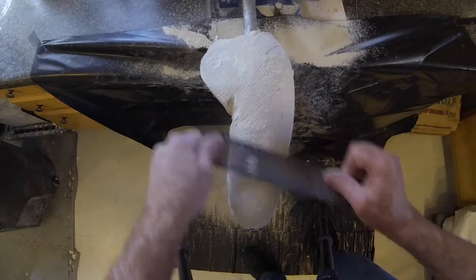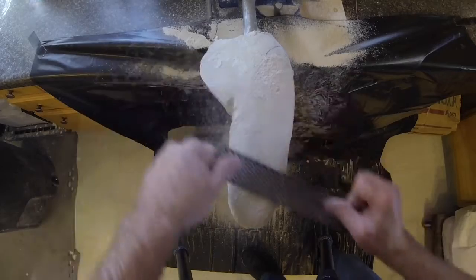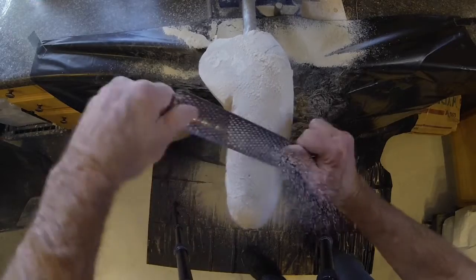Begin to remove a greater amount of plaster material proximal to the cut end of the humerus on the anterior surface. This will help relieve the sensitive end of the bone and limit motion within the socket.